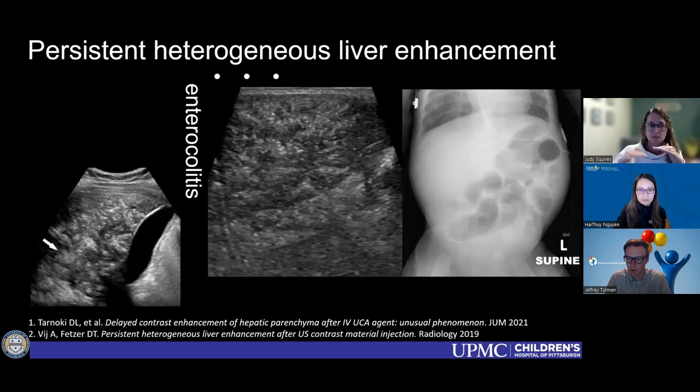The peak enhancement will be some weird negative decibel value, and depending where I put my ROI, that value can change wildly when it looks like it shouldn't change that much. So I'm skeptical of, at least on my machines, the TIC values. The comparison over time is where it's at. So using each patient as their own internal control and following them over time is more helpful than absolute numbers, you feel like?